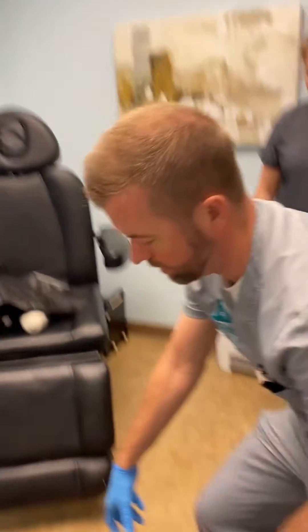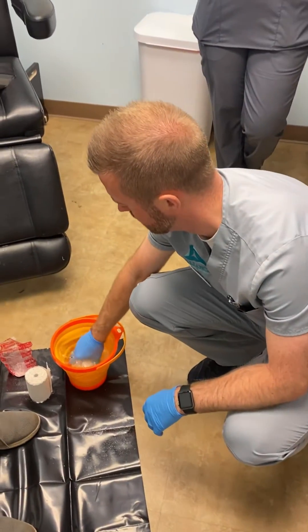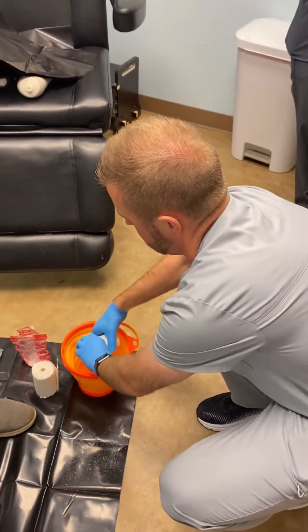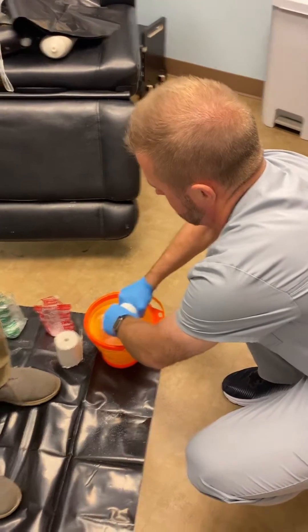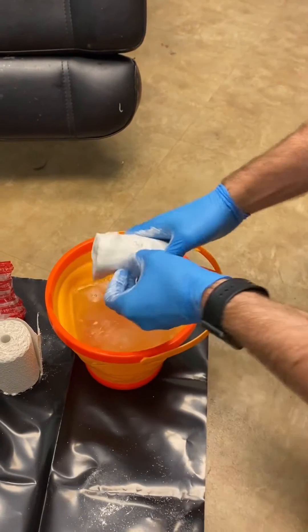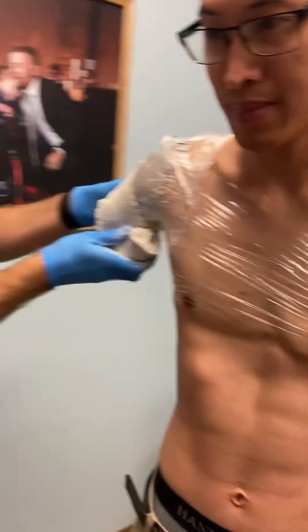Today we're going to be casting our buddy Ty for a new socket for his transhumeral amputation. We're using plaster — specifically elastic plaster for the first roll — and we're going to wrap around and get a little bit of compression.